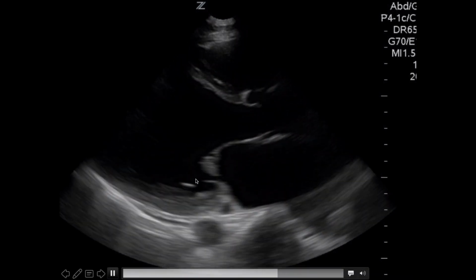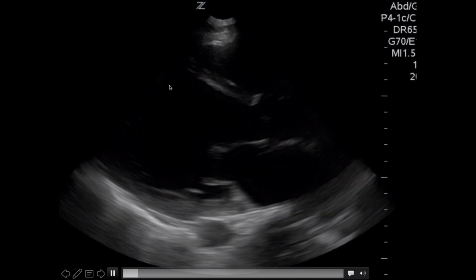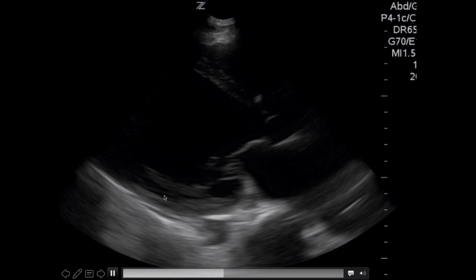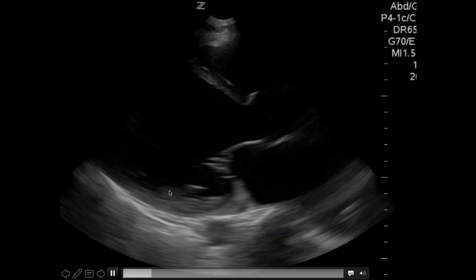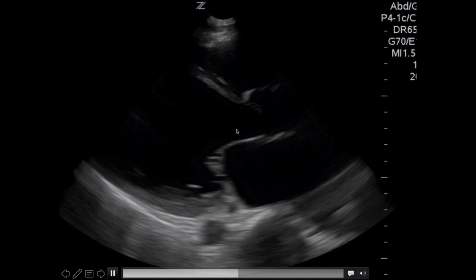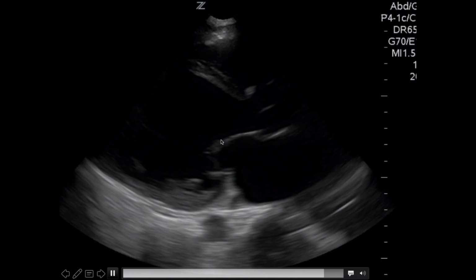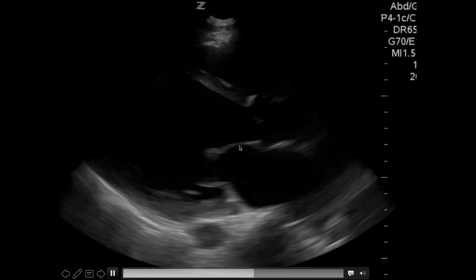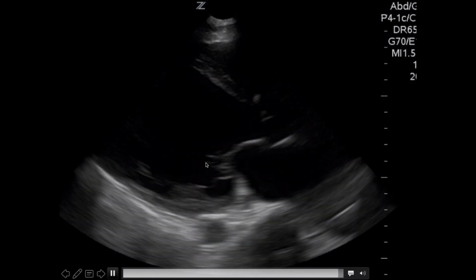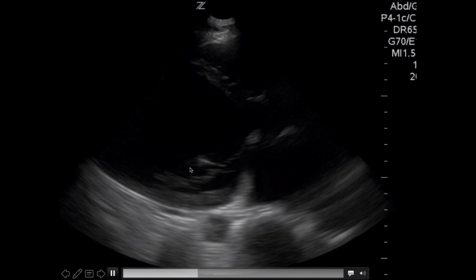In this view, the left ventricle appears very dilated. There is all this real estate, all this blood hanging out in the middle and not going anywhere. And I say that because if I look at the muscle on either side of the left ventricle, it is not squeezing, it's not pushing that blood through the aorta. Additionally, we always like to look at the mitral valve here and the anterior leaflet, what distance it gets to the interventricular septum. And it's not even getting close, it's barely opening at all. Also, the aortic valve is barely opening at all.